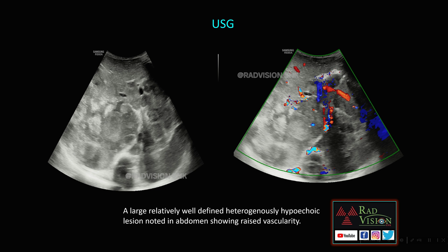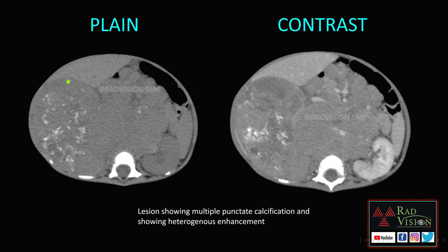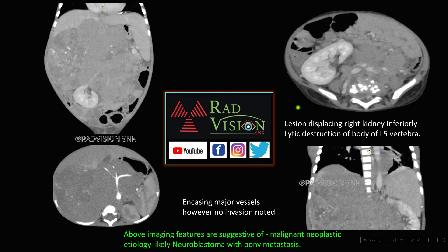On ultrasound, there is a large heterogeneously hypoechoic mass lesion crossing the midline to the left side with raised vascularity on color Doppler. On CT, a large soft tissue density lesion with multiple punctate calcifications is seen crossing the midline. With IV contrast, it shows heterogeneous enhancement with areas of necrosis, crossing the midline behind the aorta, causing elevation of the aorta from the vertebra. Coronal sections show the mass displacing the right kidney inferiorly with complete destruction of the vertebral body.